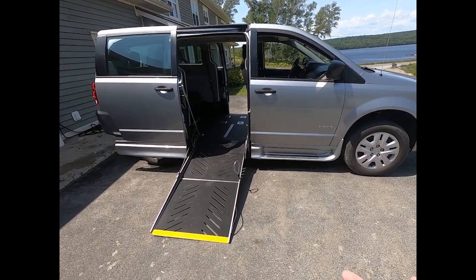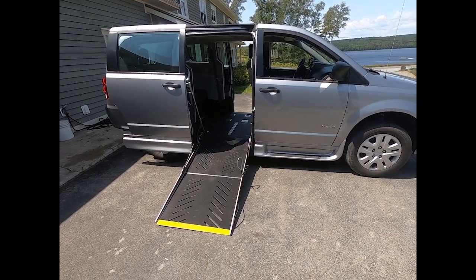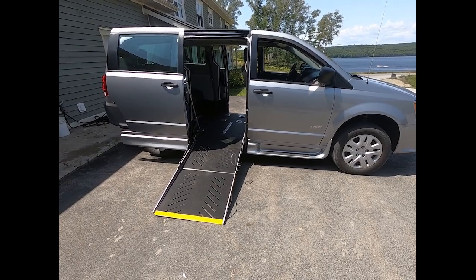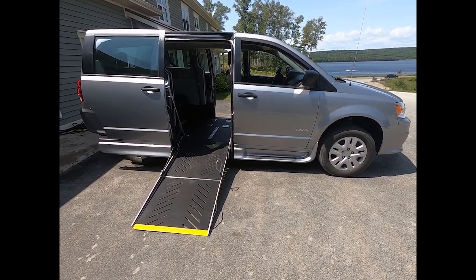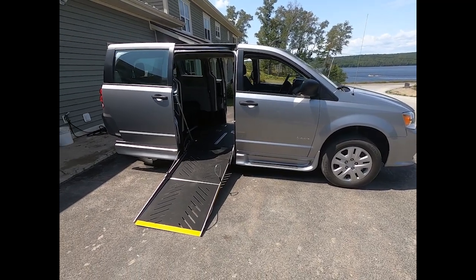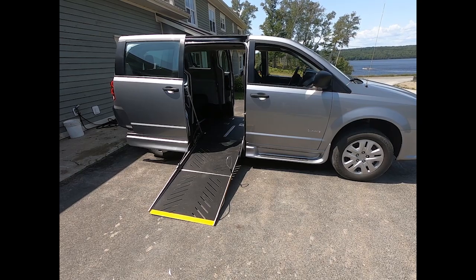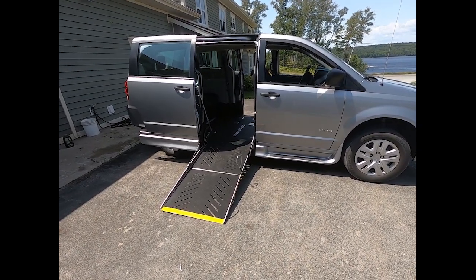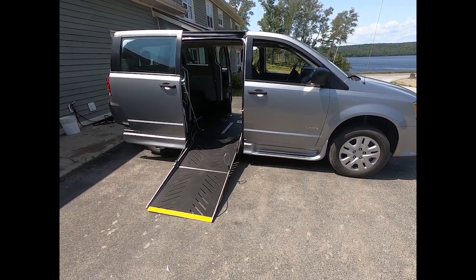Then there are manual ramps, where you grab onto the ramp and physically move them in and out. Those are more what we call a caretaker van — for when you're moving around a family member and always have someone with you. So it's not usually possible for a manual ramp to be actuated by someone in a wheelchair. It's just out of reach, you have to reach very low, and you don't really have a way to close it when you're on either side of the ramp. So it gets complicated.